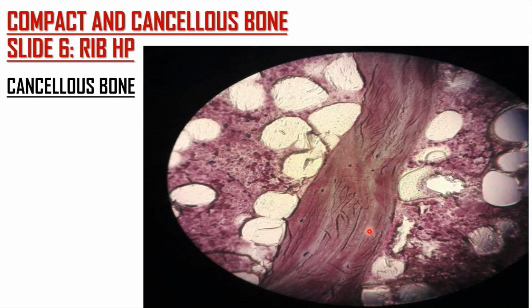As you can see in the trabecula here, you can see this cell here, this cell here, and so on. These cells are in spaces called lacunae. So there's a lacuna, and inside of the lacuna you've got cells that are known as osteocytes. So draw this. These are collagen fibers, and then draw the lacunae.